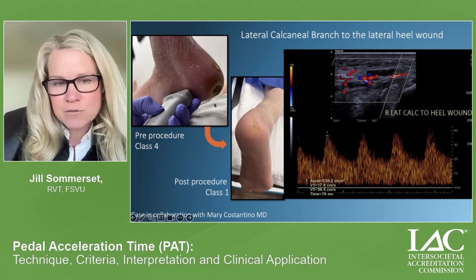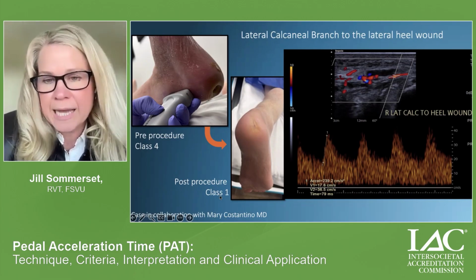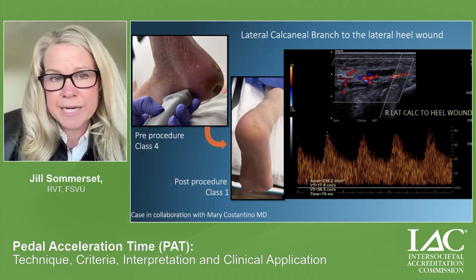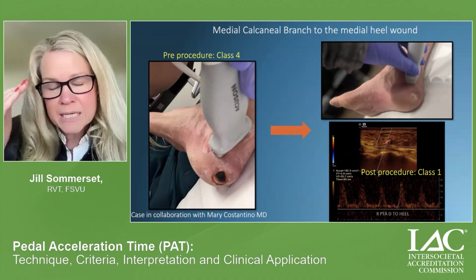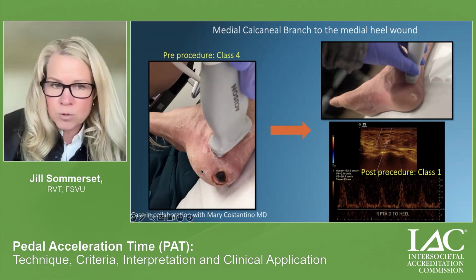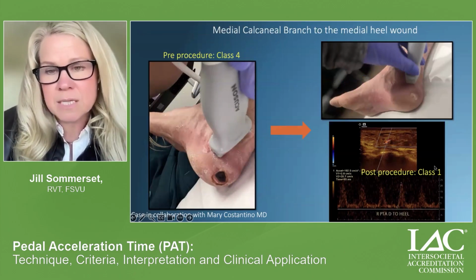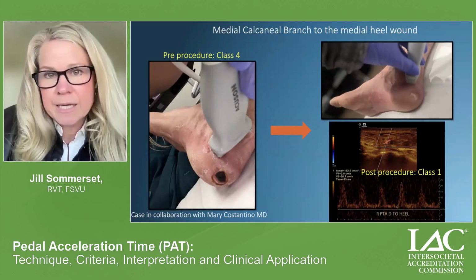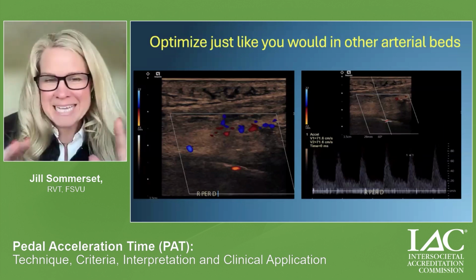This patient here was class 4 PAT, and after revascularization went on to class 1 PAT and healed his wound very nicely. This patient had a medial sided heel wound. So now I'm thinking about the medial calcaneal branch. And so class 4 pre-procedure, class 1, he did very, very well. So a lot of promising results in evaluating heel wounds.